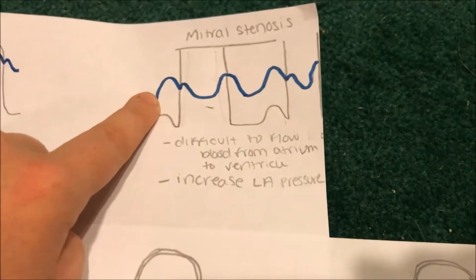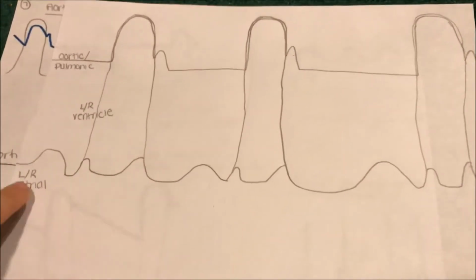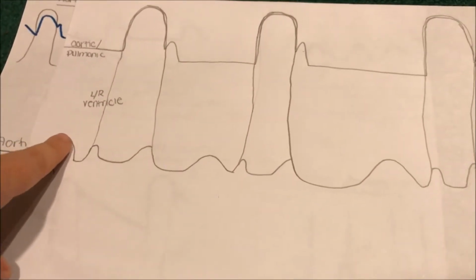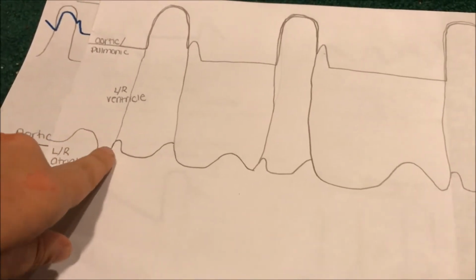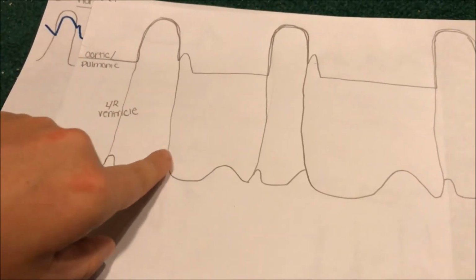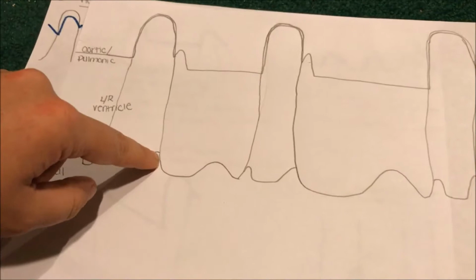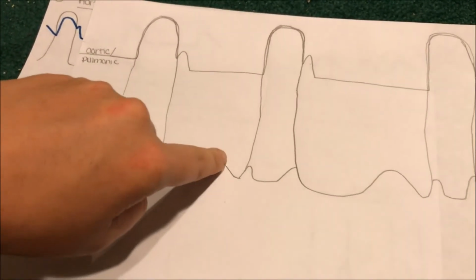Mitral stenosis, you have the blood, the levels start actually up here. In a normal waveform, it's down here and it matches and lines up with the ventricle and it becomes one chamber at that point. So the ventricle is actually following the atrial pressure when it comes to here. This is where the valve closes, so they go their two separate ways. This is still the atrium, but then they meet back up when the valve opens again and they trace each other. They are both right here, ventricle and the atrial waveform.